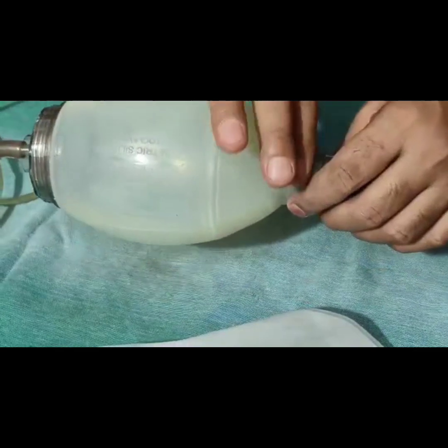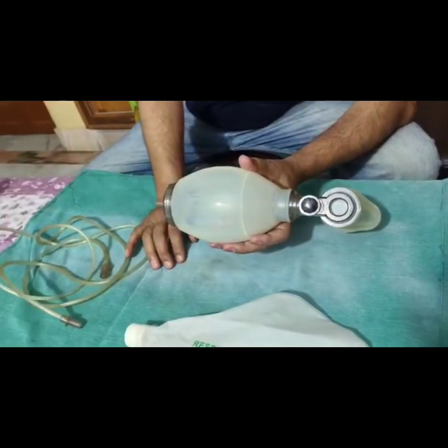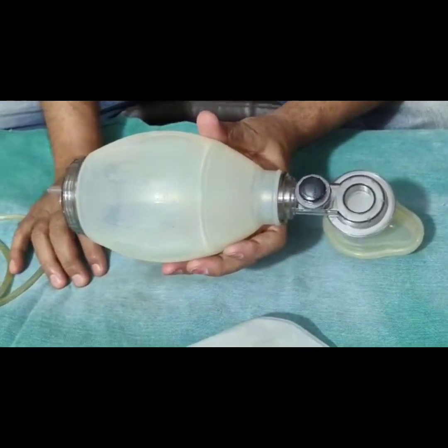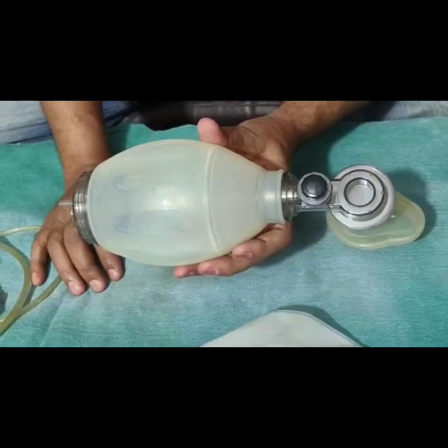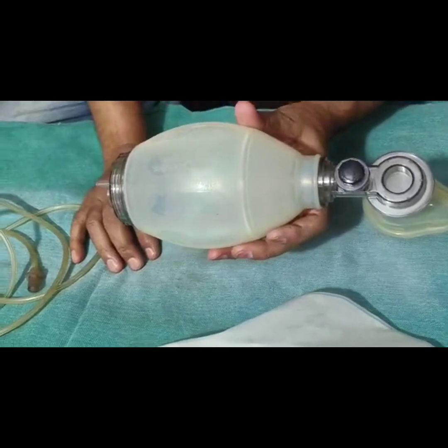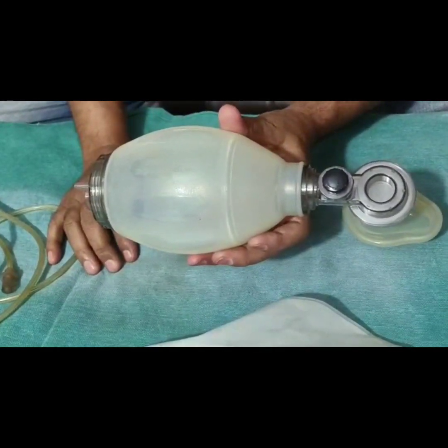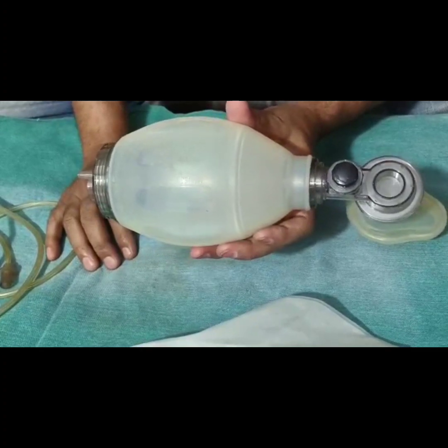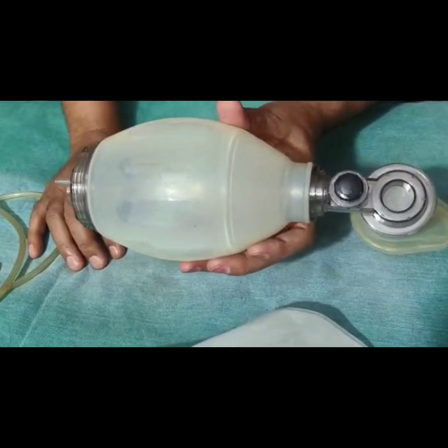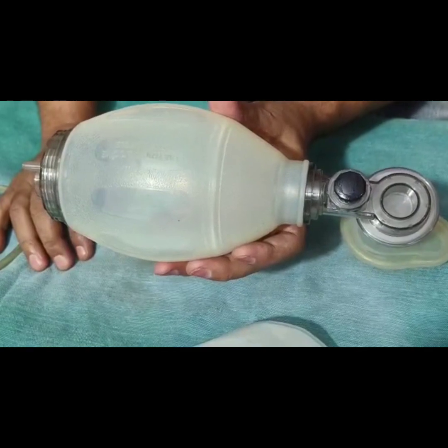The Ambu Bag is specially used in neonatal resuscitation where babies are apneic and cyanosed, there is no spontaneous respiratory effort, or the heart rate is less than 100 beats per minute. It is used for giving intermittent positive pressure ventilation (IPPV).